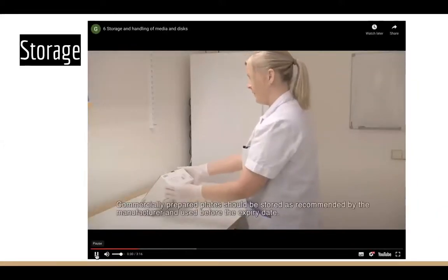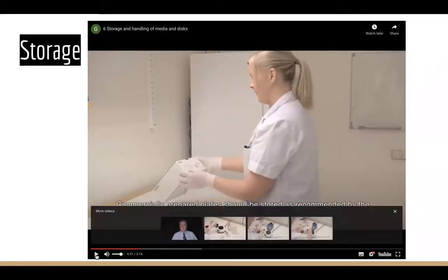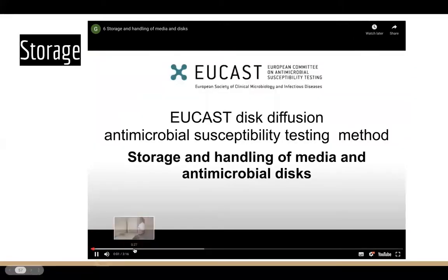Commercially prepared plates should be... So by the quality assurance program, I suppose it means you just have a cutoff. So make sure that if you've decided that your plates are good for 2 weeks, you have them for 2 weeks, and then you don't just keep on storing some of them for longer, but you get rid of them at a certain point. And so everything's kept at the same sort of conditions.